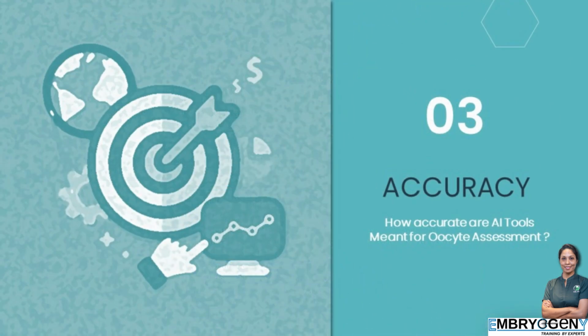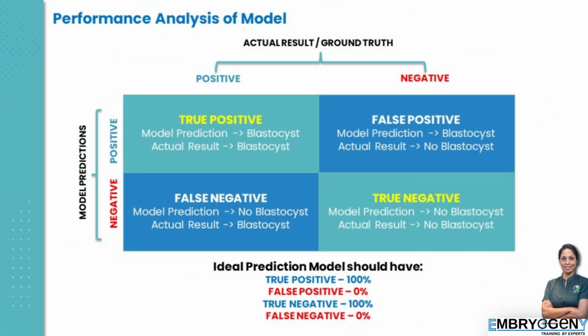This brings us to the accuracy of AI-based oocyte assessment. For this, please revise statistics relevant for assessment of prediction models a bit.